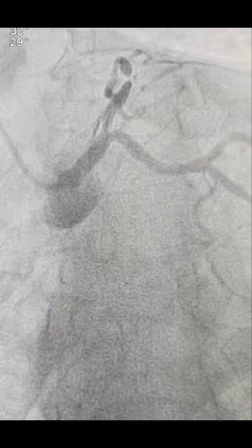This was a 56-year-old male patient who presented to the emergency department with typical chest pain. On ECG, there was ST elevation in V1 to V4 with RWMA in the LAD territory on echo. Then after all clearances, the patient was taken for the angiogram.